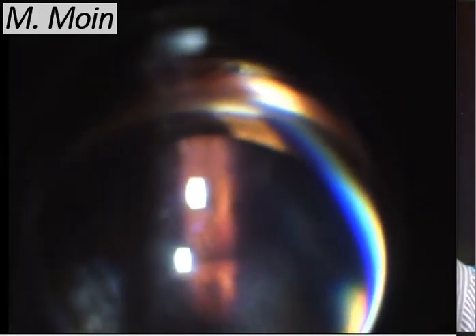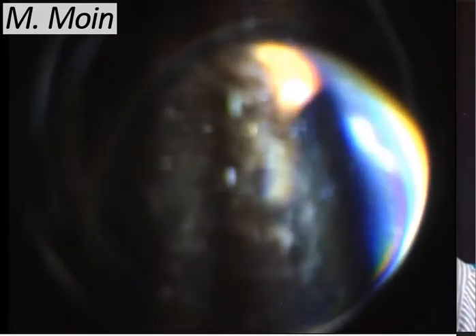If you're trying to see the same patient with a 90-diopter or 20-diopter lens it'll be difficult. With an indirect ophthalmoscope, a 28-diopter lens will be better. Seeing the retina after gas fill can be slightly challenging with the indirect, especially on the first day post-op with a 20-diopter lens.